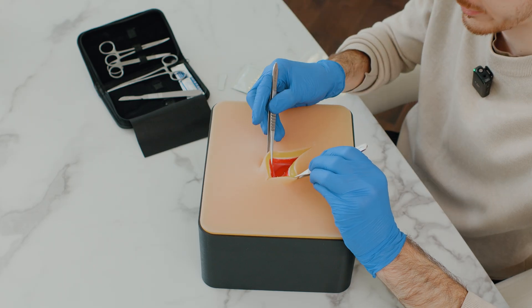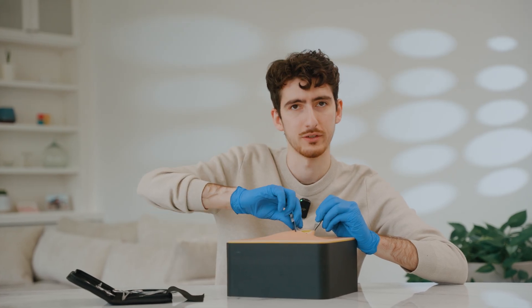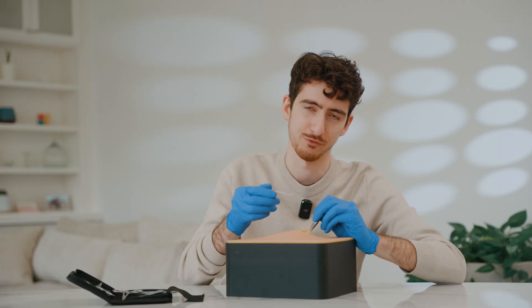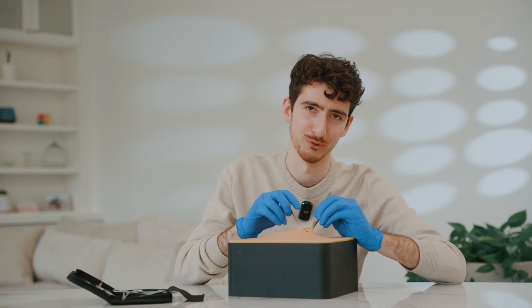As soon as we advance through all the skin layers, you will be able to see the balloon positioned under the silicone model. This gives us an idea of how the intestines would be positioned inside the body. So you have to be very careful not to puncture the balloon.